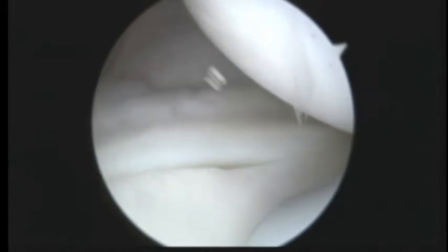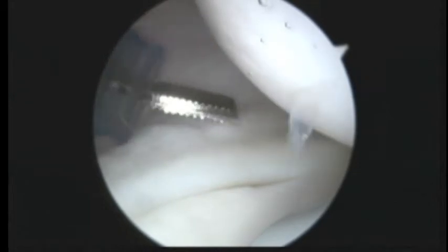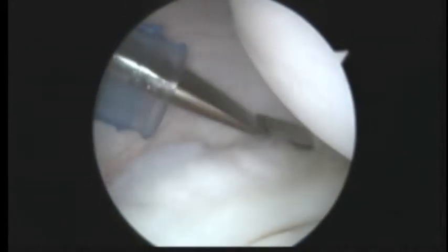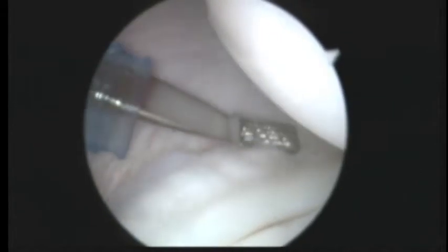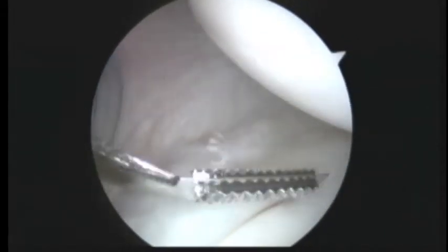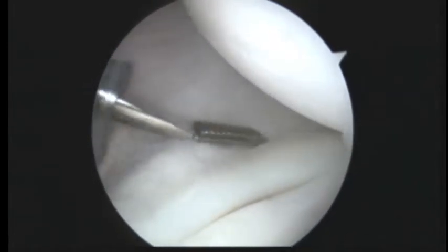So the next step is to take an instrument called a rasp, which is this instrument here. What this does is it just roughens up the soft tissues. Basically what we're trying to do is make this like a piece of Velcro so it'll stick. Let's see if I can focus a little bit better. So you can see the ridges on it. We'll go ahead and roughen up here.